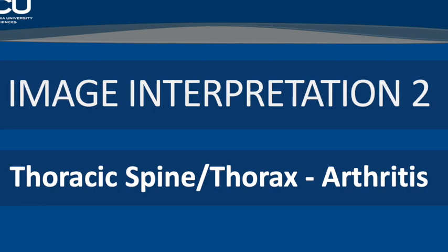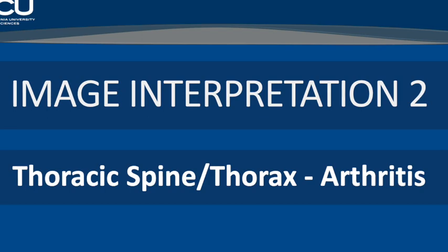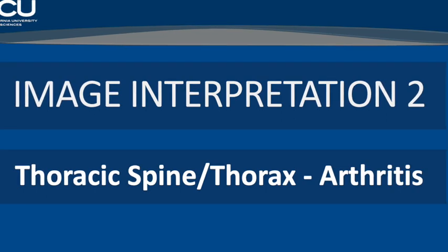Transitioning now to our next case, a 50-year-old male with fatigue, chest wall pain, and a rash. The imaging findings demonstrate features consistent with dermatomyositis or polymyositis. Dermatomyositis is an autoimmune condition that attacks the muscles and skin. It typically starts in the proximal lower extremities before progressing to the upper extremities and neck muscles. Patients can develop an associated non-erosive, transient arthritis. There may also be pulmonary manifestations related to the underlying autoimmune process.